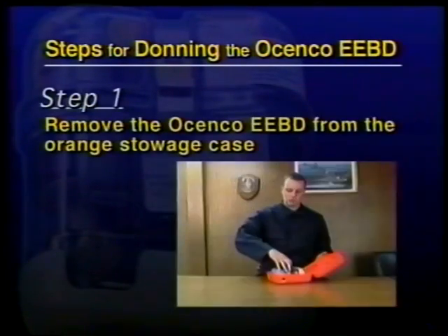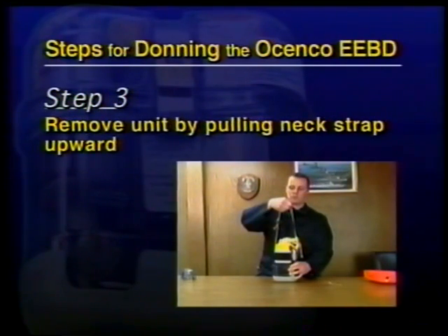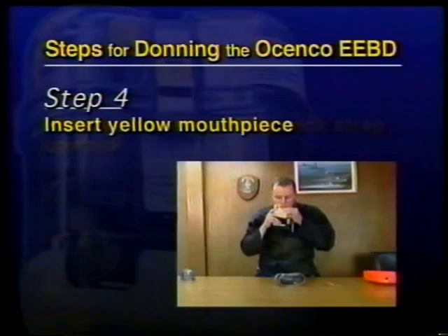The donning steps are: Step 1, remove the Osinko EEBD from the orange stowage case. Step 2, lift the yellow lever and discard the cover. Step 3, remove the unit by pulling the neck strap upward.